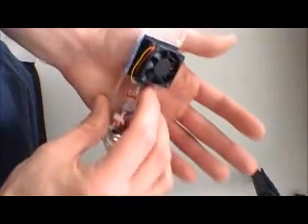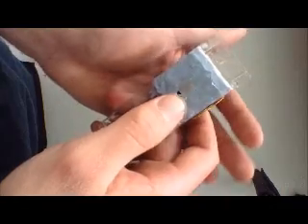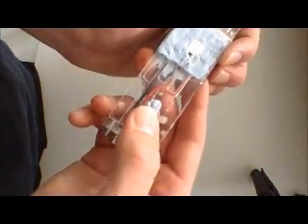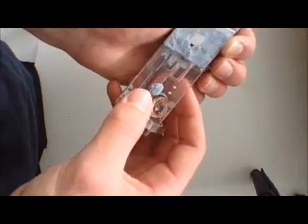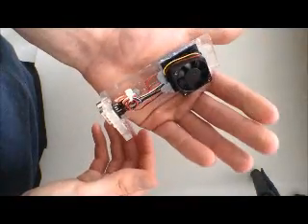So it will sit on your hand as shown. An RTD, which is a small white dot there, will record the temperature of the cooled area on the thenar region of the hand, and the white dot there, another RTD, will record the reference temperature, which is the hypothenar region. And it'll sit in your hand just as shown.